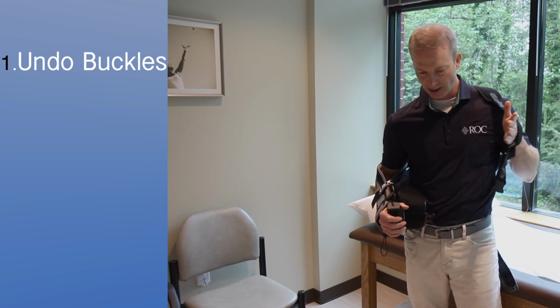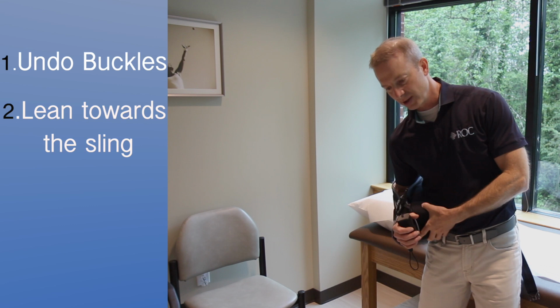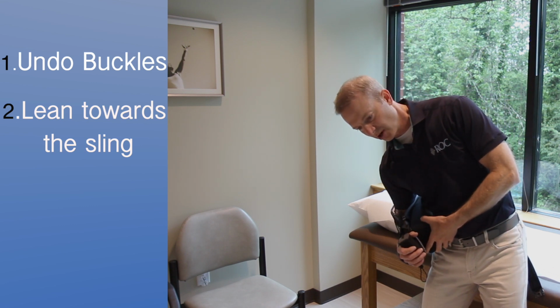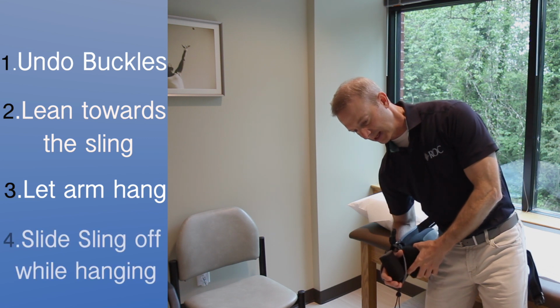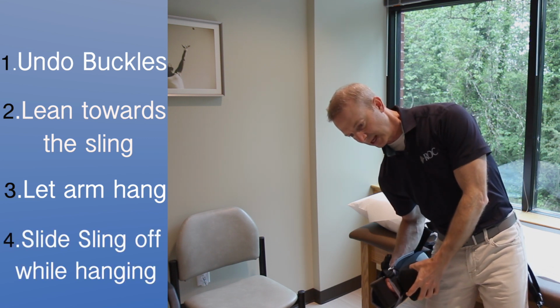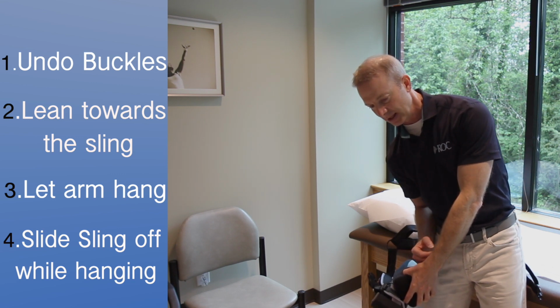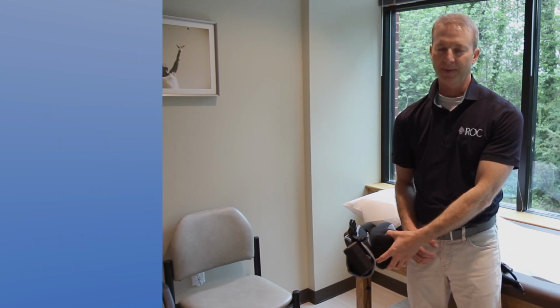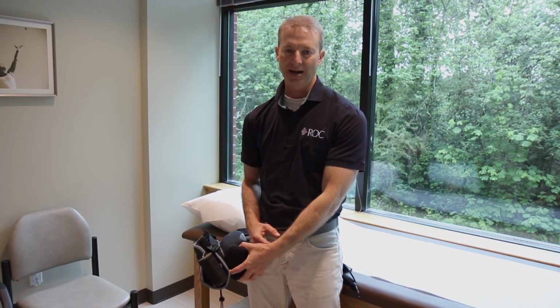slip your non-operative arm out of the sling, and then lean towards the sling and let your arm hang freely, and then slide the sling off while you're in that hanging position. Bring the arm back to your side, and then you can stand back up. And that's the best and the safest way to remove the sling after a repair.